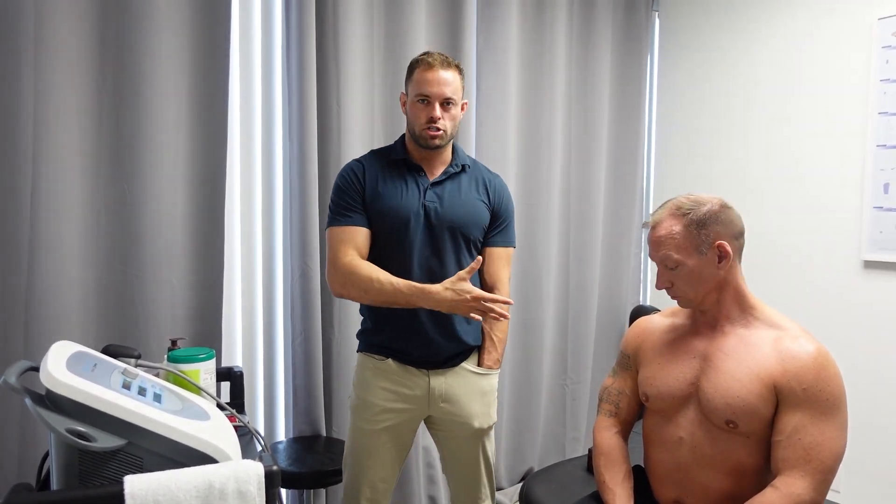I've had it in my office for about four months now and the results have been unbelievable — whether it's back pain, whether it's tennis elbow, meniscus tears, this thing is incredibly effective. So I'm going to show you guys a little bit about how it works, and I'm going to use it on Dr. Eric's shoulder.